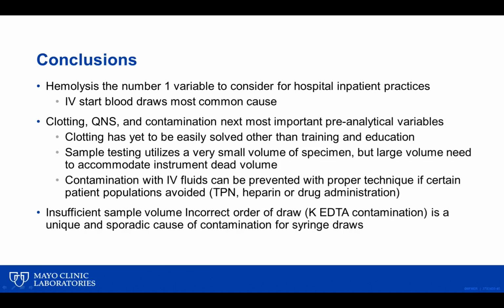With the practice of drawing blood with an IV start, usually in the ED, the best you can really hope for hemolysis rate with these line draws is 5 to 8%. And so if you avoid IV starts, you can typically achieve somewhere between 2 and 3%, which is consistent with the benchmark recommendations. If you can discontinue infusion for 2 minutes, you have that 5 cc discard at a minimum, and you find some ways to deal with your heavy hitters like that magnesium, calcium, or even those drugs, so collecting at appropriate times, you can dramatically reduce contamination.